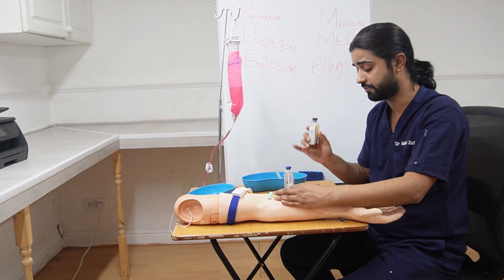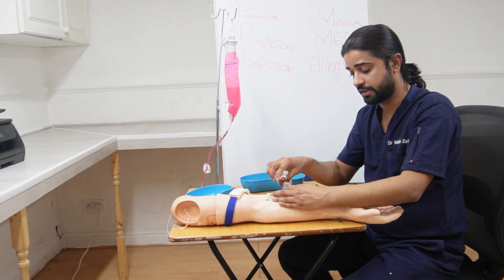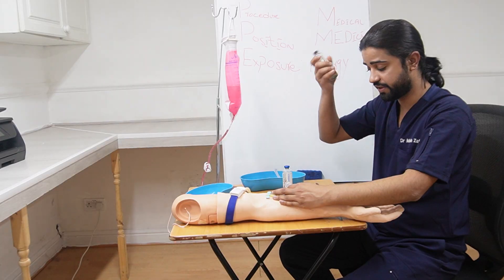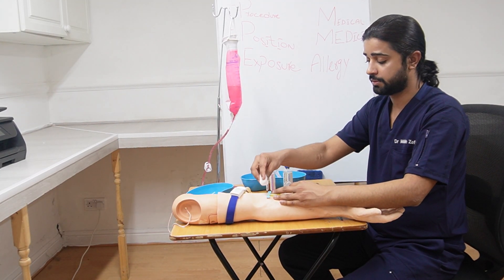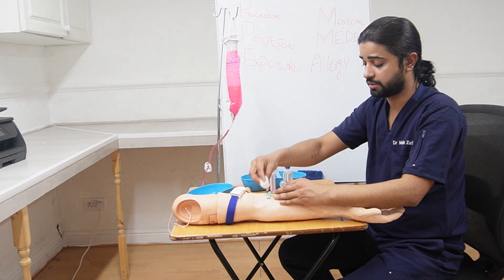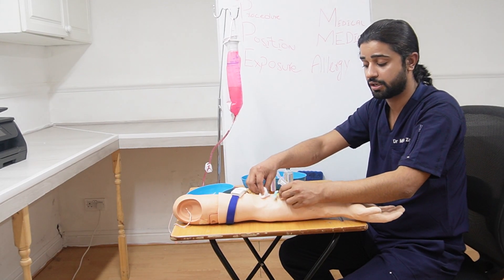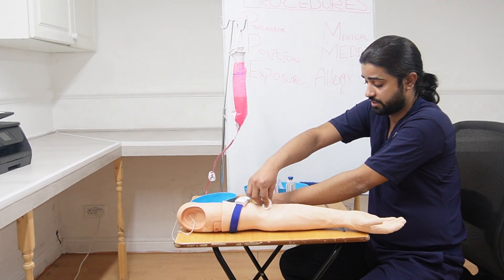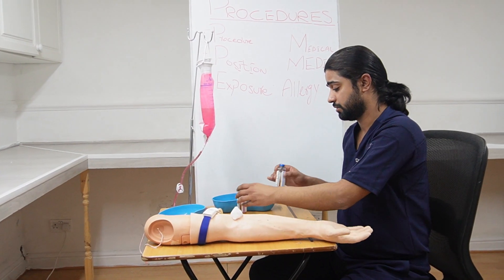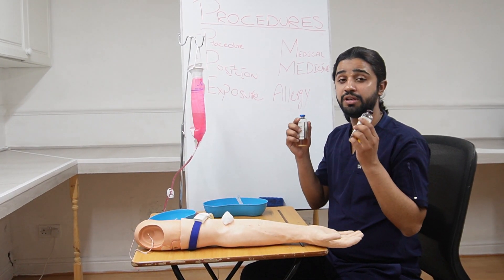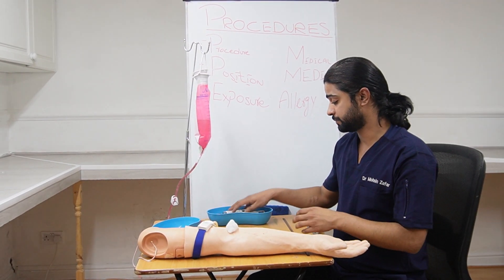After the blue aerobic bottle, use the brown one, which is anaerobic — brown after blue. Insert it, take the sample, and rotate it 180 degrees as well. Then place the cotton over the site, let the patient know, and take the needle out. Ask the patient to press on the site for one minute. Then label the bottles with the patient's details and send them to the lab.